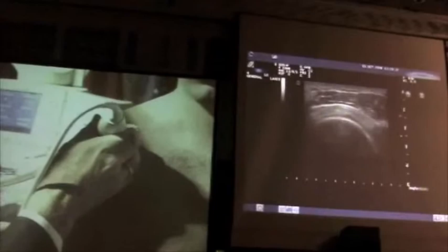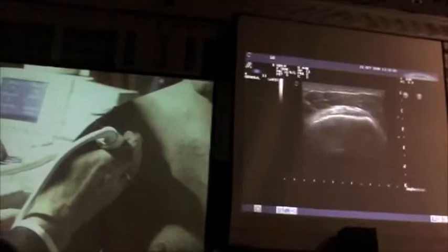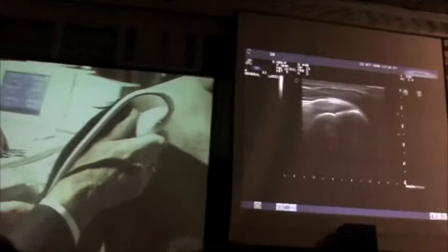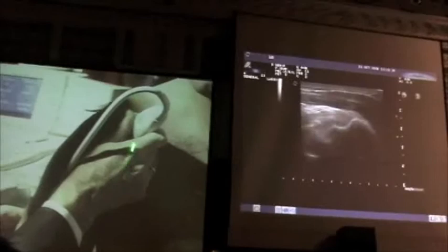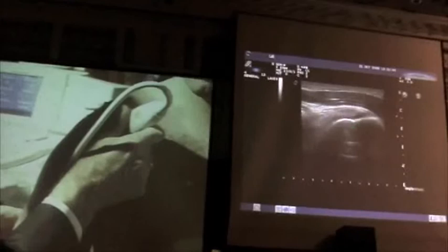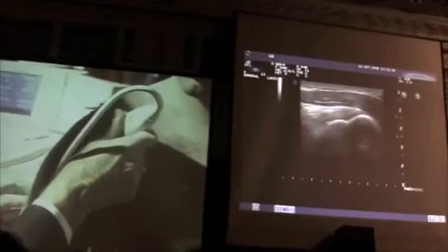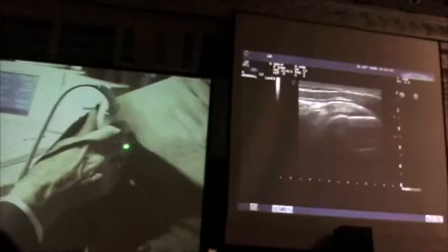In scanning the supraspinatus, you start up high against the coracoracomial ligament, as you can see on top, and you move down the transducer trying to stay nice and parallel. The cartilage over the humeral head is an anechoic tissue layer. You move down towards the base and the attachment of the supraspinatus tendon. Then look at the same tissue on the longitudinal axis, and first move your transducer close to the biceps. You notice the anatomy of the humerus — the humeral head is the round surface, then the little groove that is the anatomic neck of the humerus, and then the greater tuberosity footprint of the supraspinatus is that long flat surface. Make a sweep keeping your transducer perpendicular to the surface of the greater tuberosity — very important.